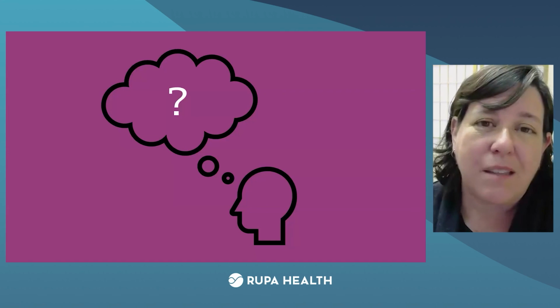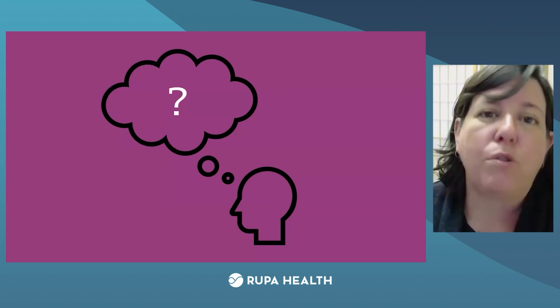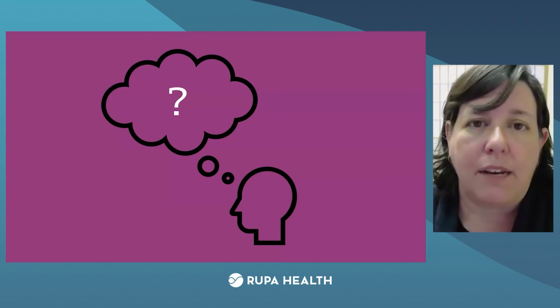And for some people, that's the best time to get an empty stomach and a fast, as close to fasting as they can, because they may have to take other medications first thing in the morning, or they're just really bad about remembering, but they'll remember at night every night.